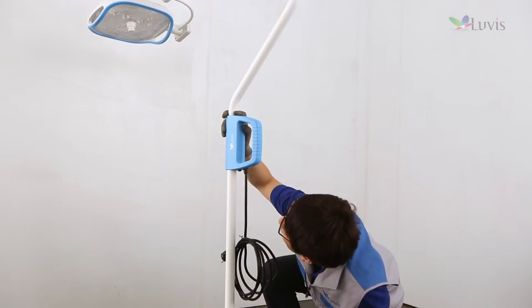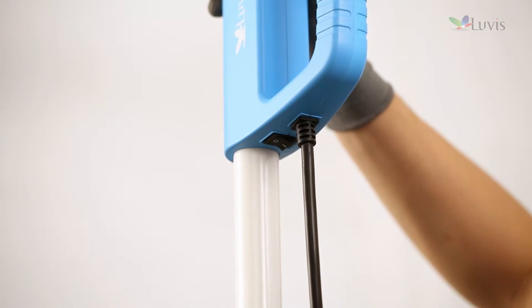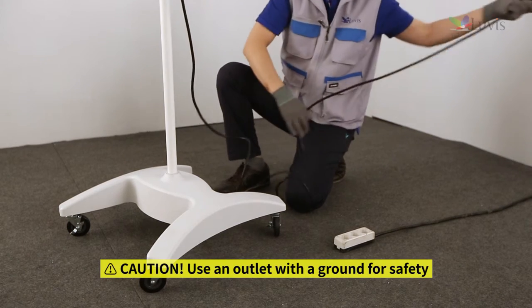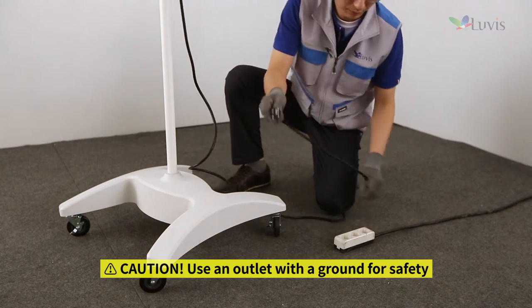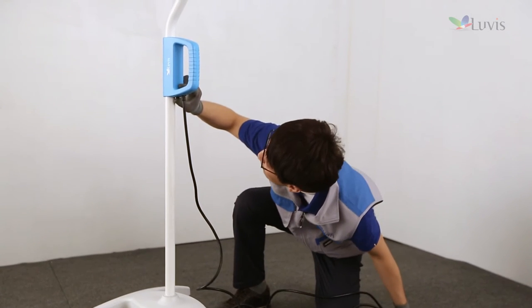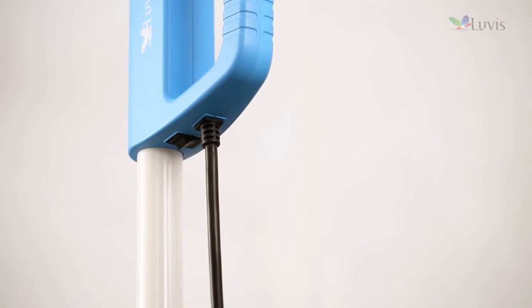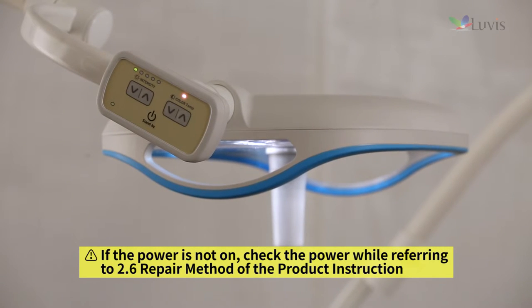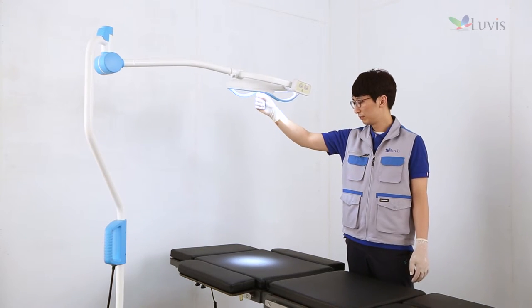Check whether the power switch below the vertical arm control handle is off. Plug the product power cord into an AC 100–250 V outlet. Press the power switch below the vertical arm control handle to turn it on. Press the standby switch on the head assembly's control panel. If the LED light turns on, check the product operation.